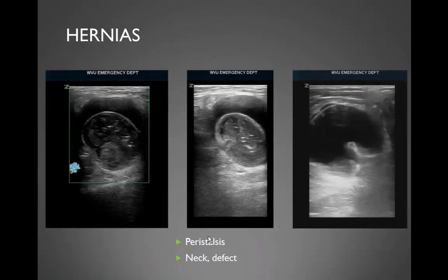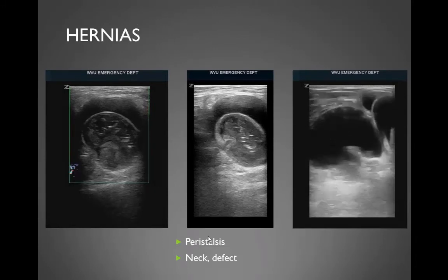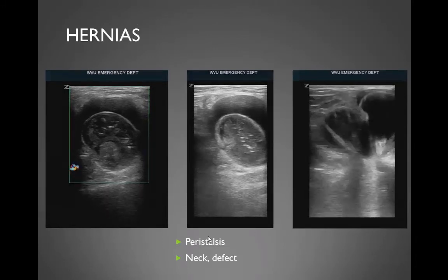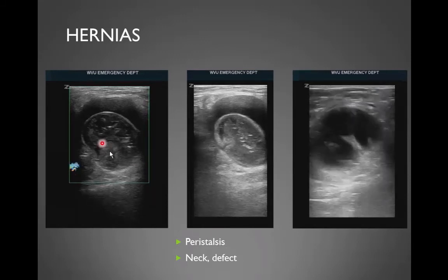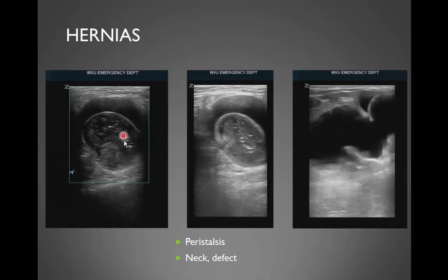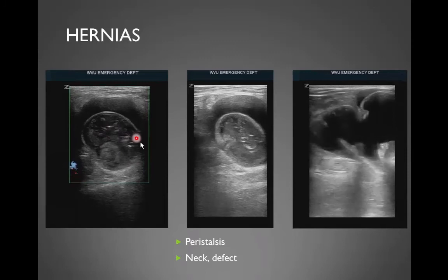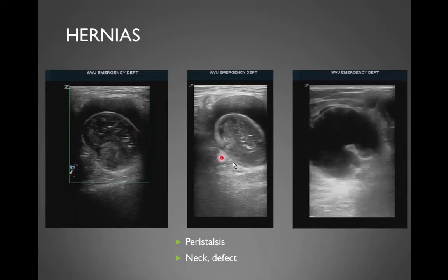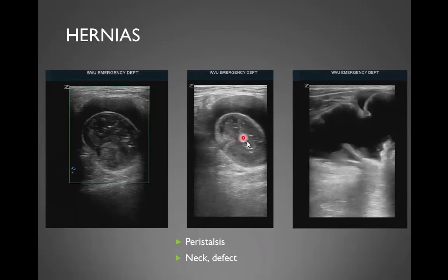And just a few other things you might see when you're looking for a soft tissue infection. You might see a hernia, and this is not a full hernia talk, but here we see there's a little bit of peristalsis in this lesion here. So peristalsis is a good finding for a hernia that would say it's not an abscess. Don't just go stick a random knife in there. Again, here we see a little peristalsis.